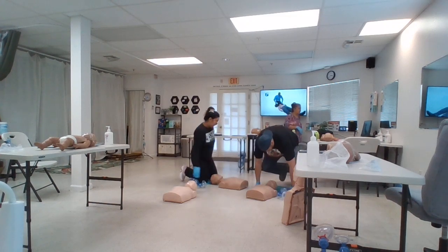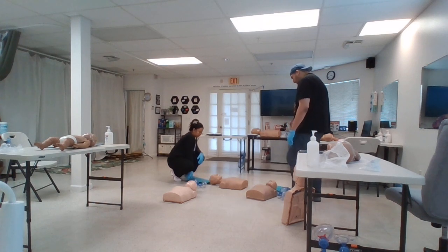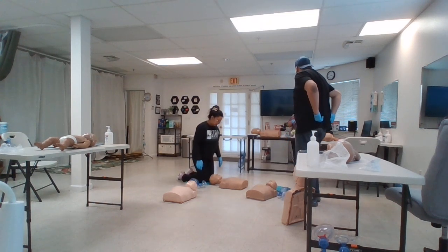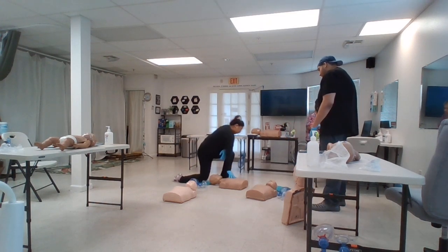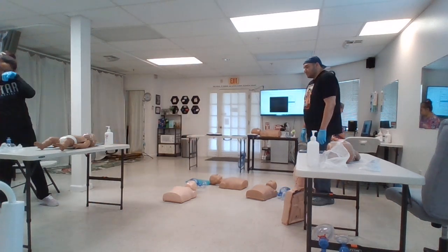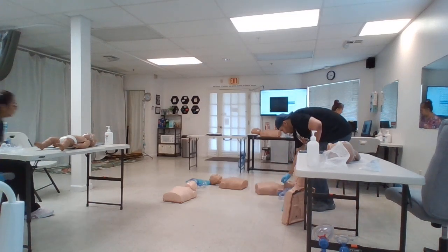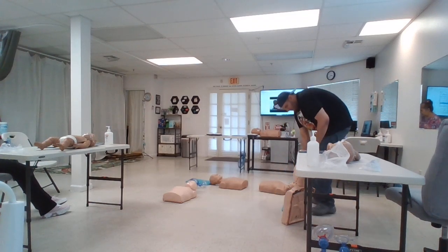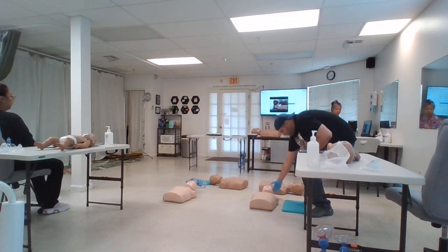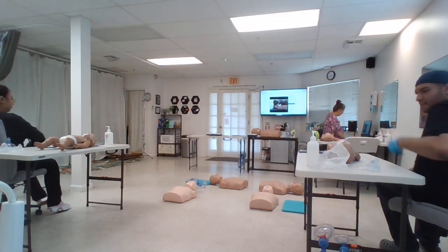Yeah, so with that one, if there are two rescuers, one person will be doing compressions while the other person will be giving breaths. So we'll go ahead and move along to instructions about the front. And after that, we'll practice rescue breathing. So we'll see the bag mask.